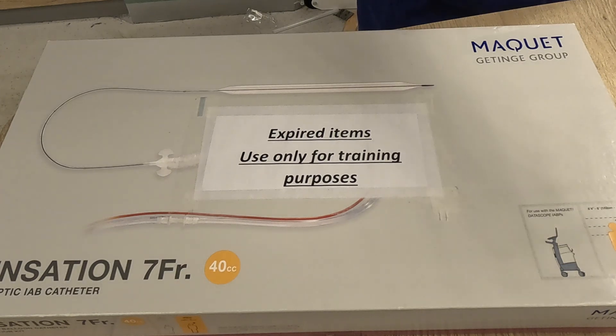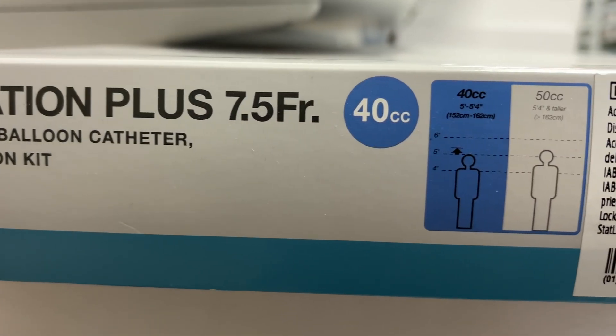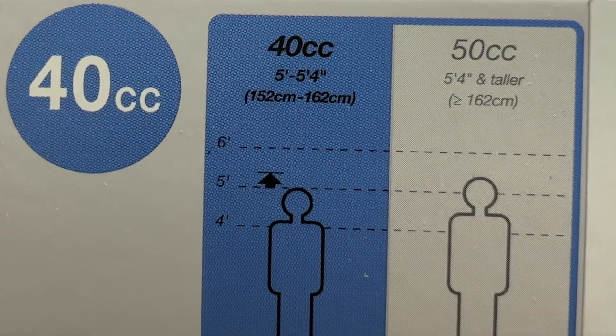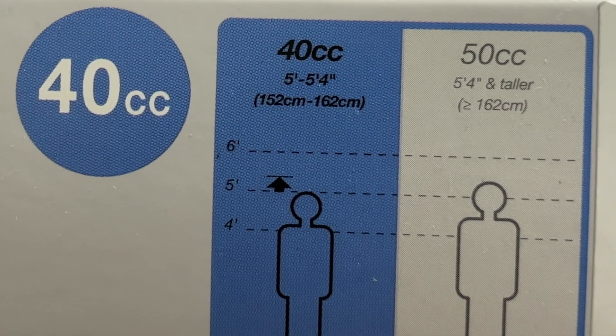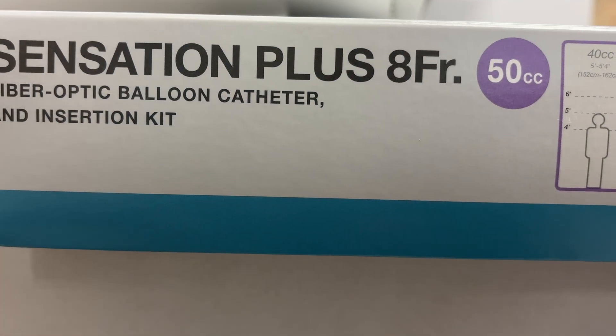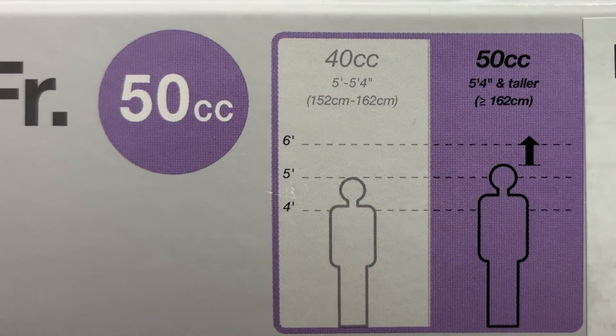Severe peripheral artery disease is also a contraindication. There are two Fiber-Optic Catheter sizes commonly used in the Sensation Plus: 40cc for patients up to 162cm, and 50cc for patients taller than 162cm.